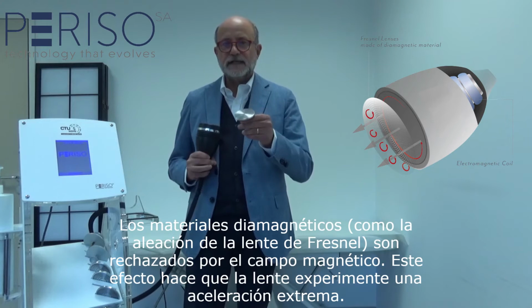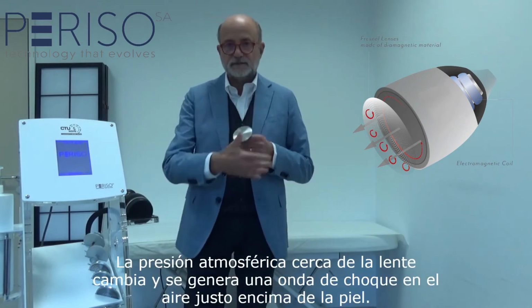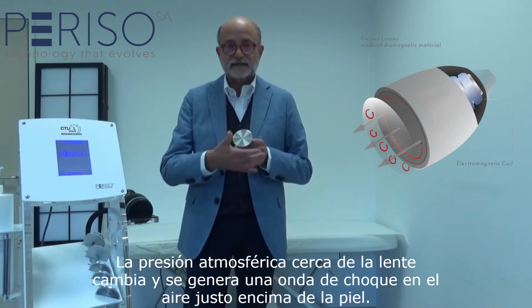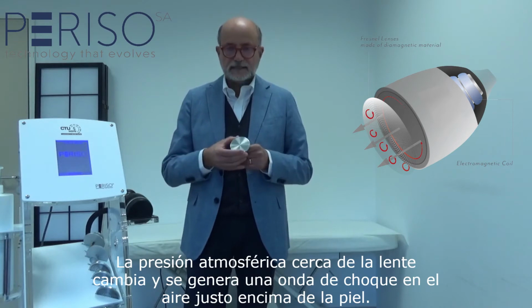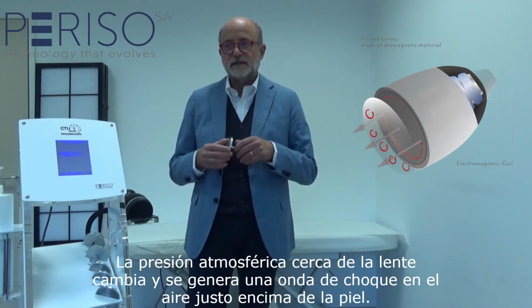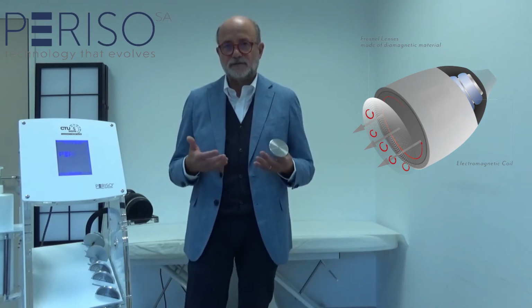Movement of the lens is up and down, and it means that the natural atmospheric pressure nearby the lens undergoes a variation, and so we can generate in the air a shock wave, a shock wave delivered by a mechanical effect.